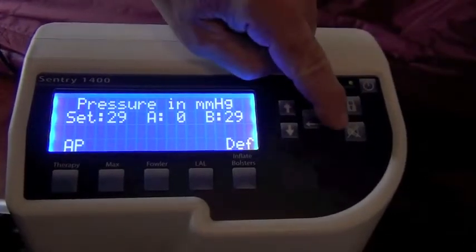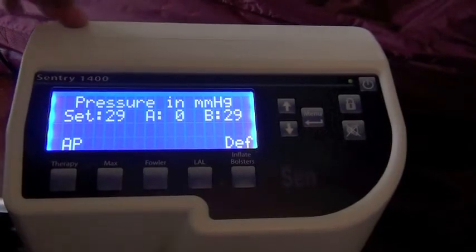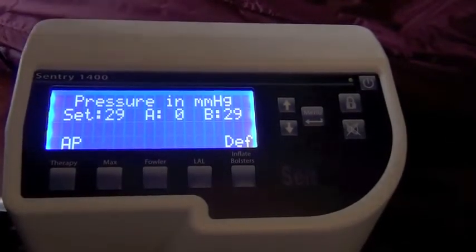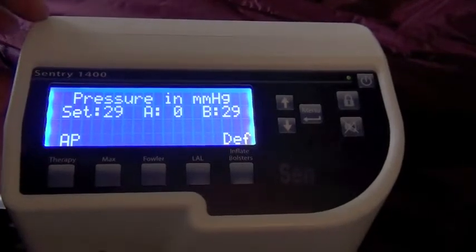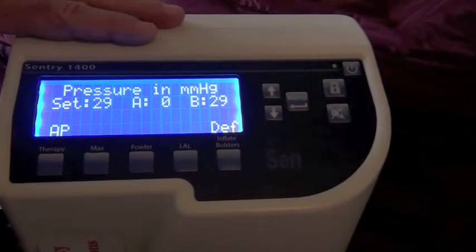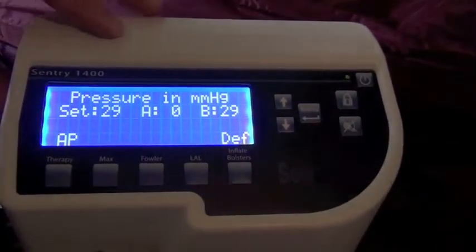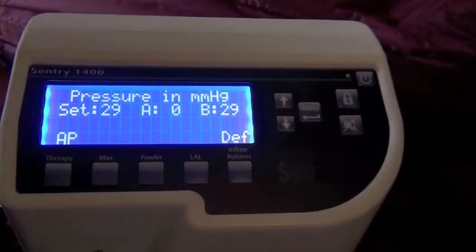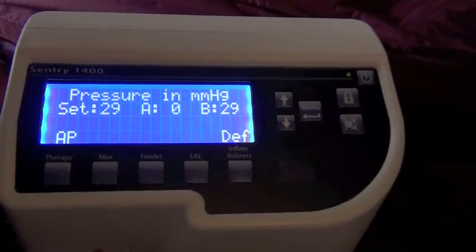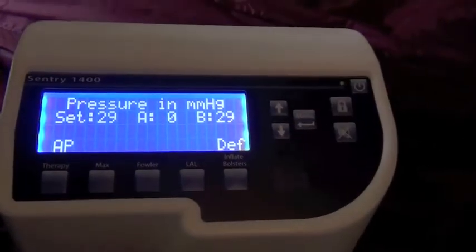The last soft pad here is an alarm silence. And there's only one alarm on this system, and that is a low air alarm, and that would be indicative of some type of an air leak. If that were to happen, you can call us with our number, which is listed here again on the air supply, and we can troubleshoot that over the phone with you. But the incidence of that is very rare. But if that were to occur, please call us, and you can silence the alarm here with this button.